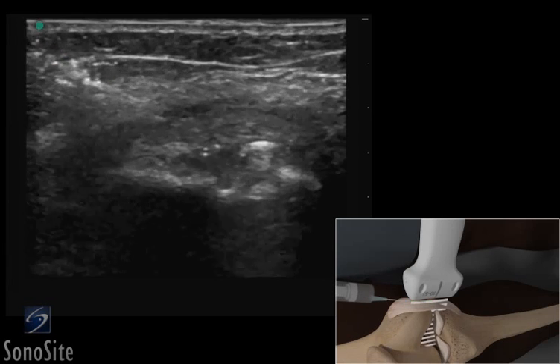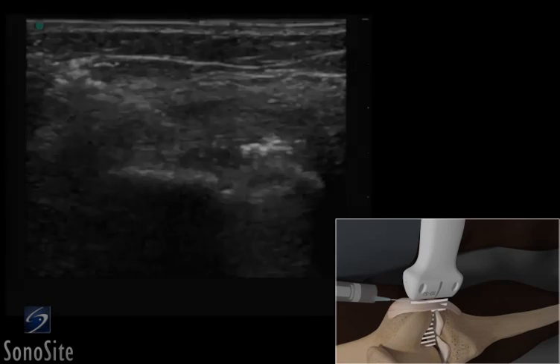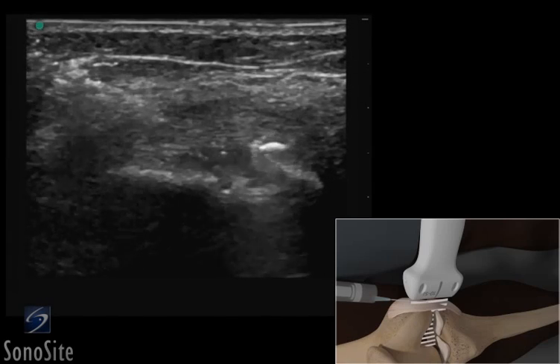The needle is slowly advanced under direct ultrasound visualization until the tip is seen in proximity to the ligament, where an injection can be done.